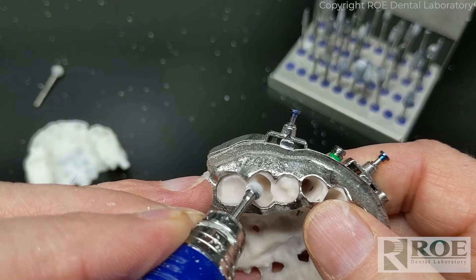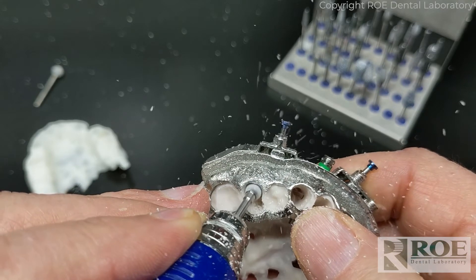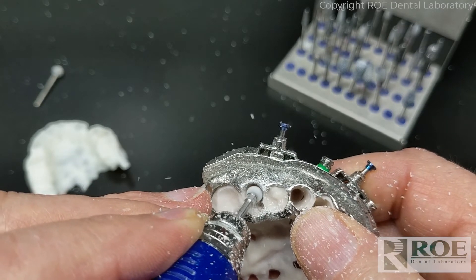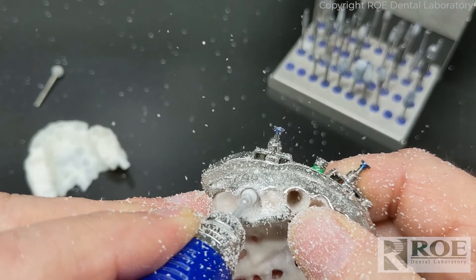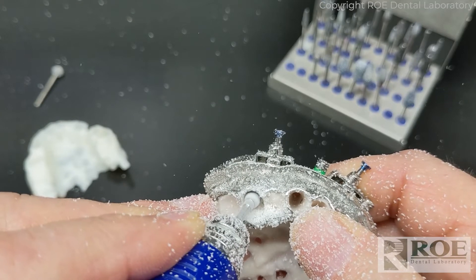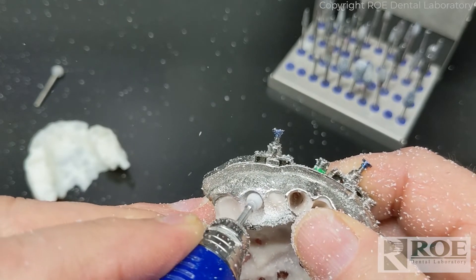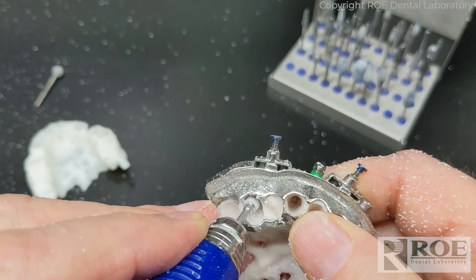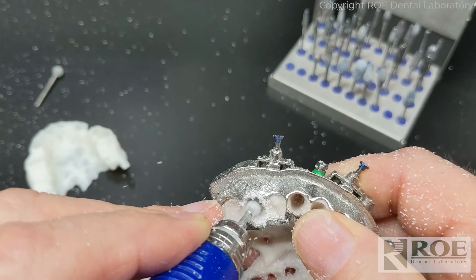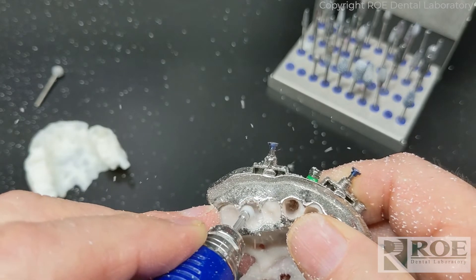I'm now going to relieve, within the scallop guide, the bone to the footprint of the tooth itself that we've created in the prosthetic. In the prosthetic we have to make these teeth sometimes a little thicker than they need to be, simply because our printing process requires the material to have a certain thickness to have a successful print.